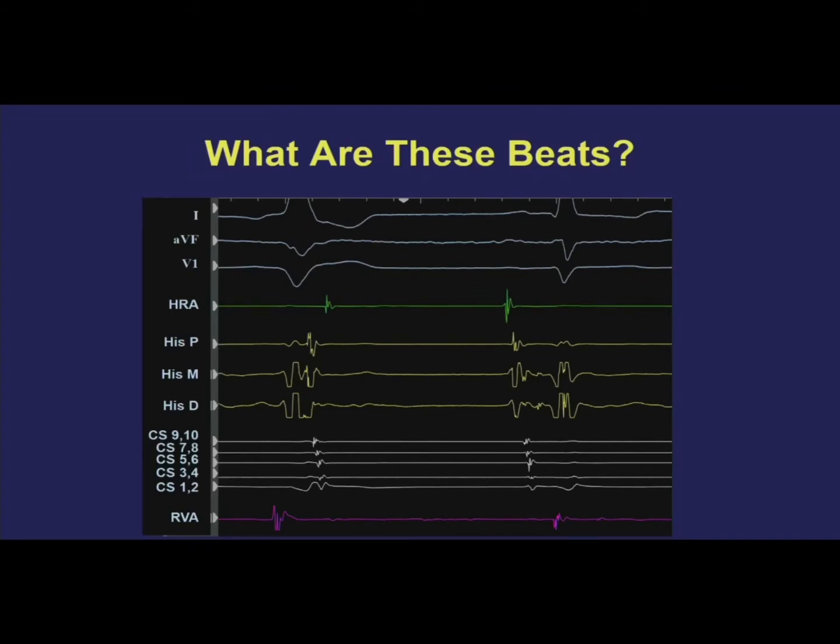I would disagree, though, about the activation sequence and the morphology. I think these electrograms do look a little different in their shape, which is a subtle thing. We'll get to activation sequence in a moment. But the fact that we have sharp signals here that line up with a P wave very highly suggests that on an adjacent beat, the sharp signals are also atrial signals. This catheter didn't wildly go to a new place between beat 1 and beat 2.